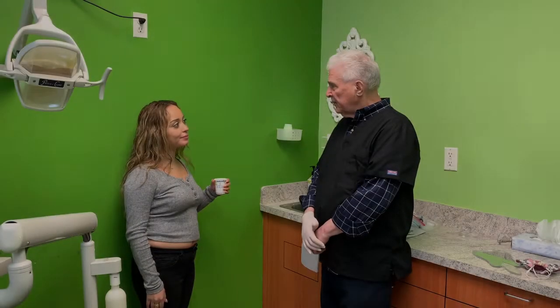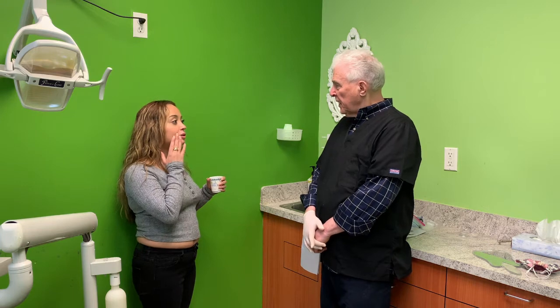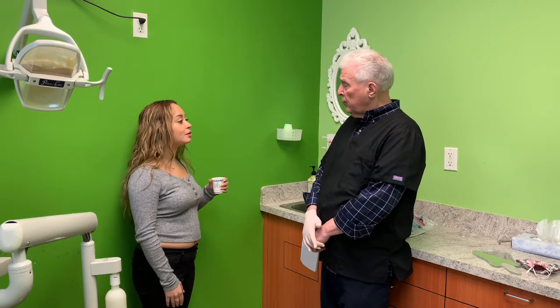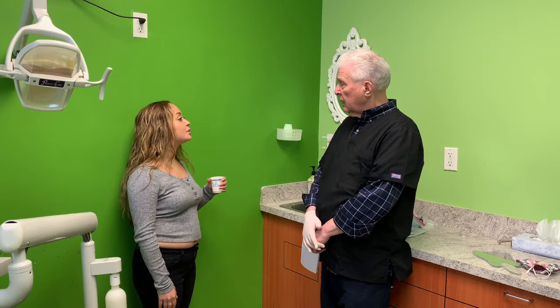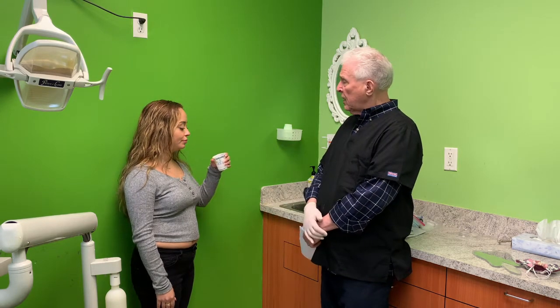Well, you're fitted. Tell me how it feels. I feel comfortable. I feel like I can speak. It sounds like you can speak pretty well. Show me how you can move your jaw. There's flexibility. Neat. Okay, now, can you drink from a cup?